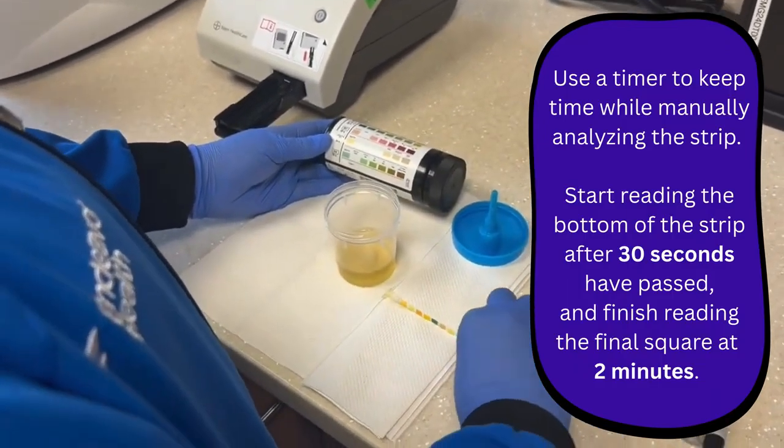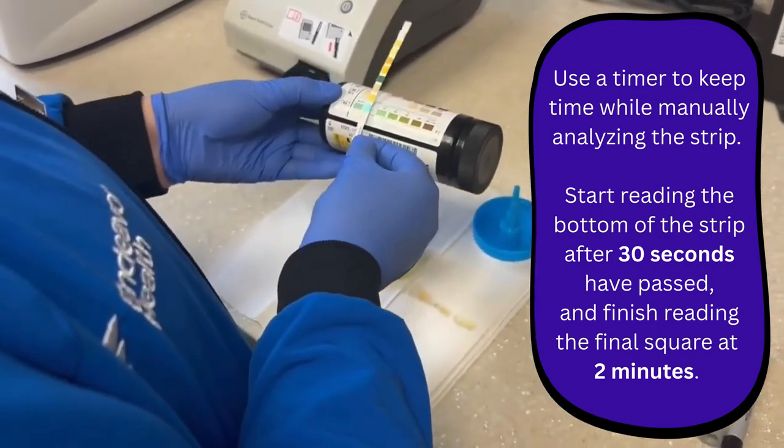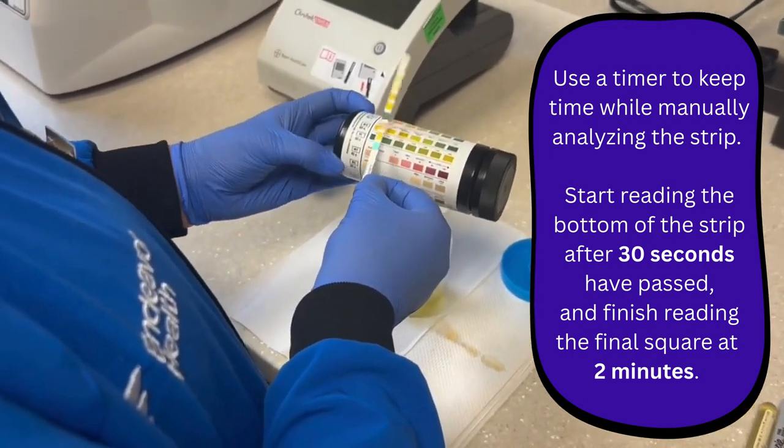You'll read the test results carefully at the time specified on the bottle label, in good light and with the test area held near the appropriate color chart on the bottle label. Do not read the strips in direct sunlight.